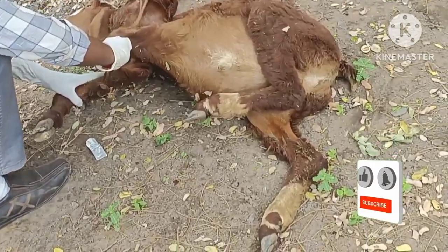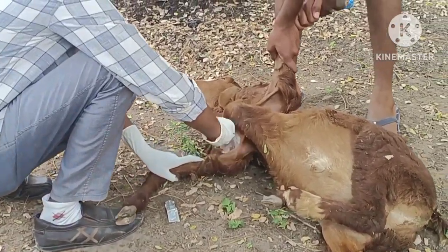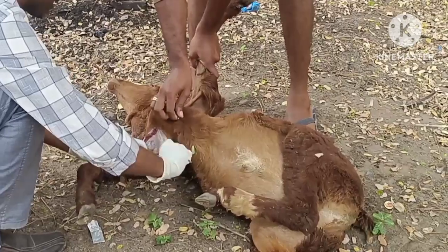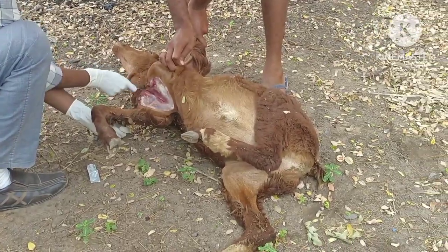In this video, I am going to explain the postmortem findings in sheep in brief, especially in field conditions. I am doing this postmortem with a simple BP blade and handle.